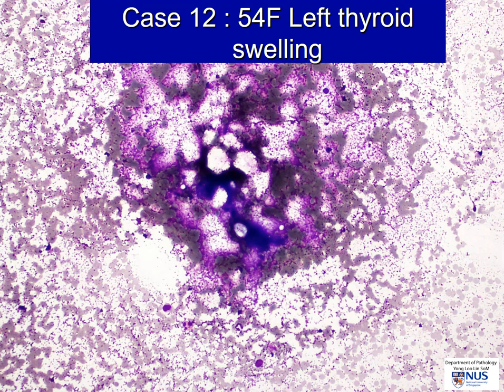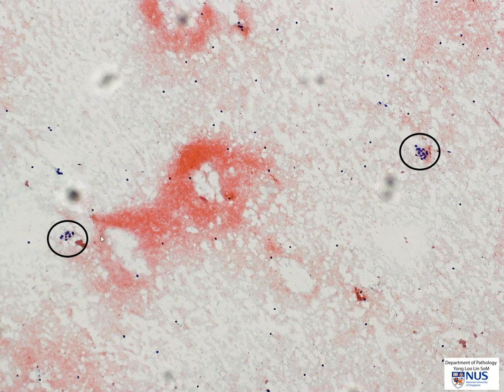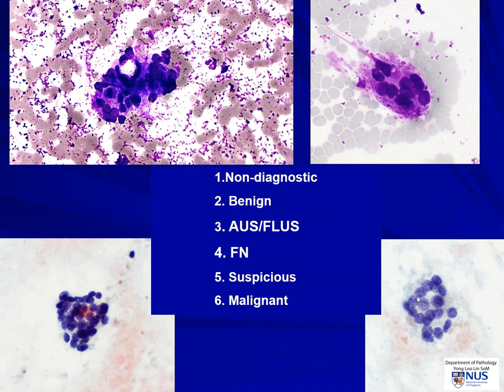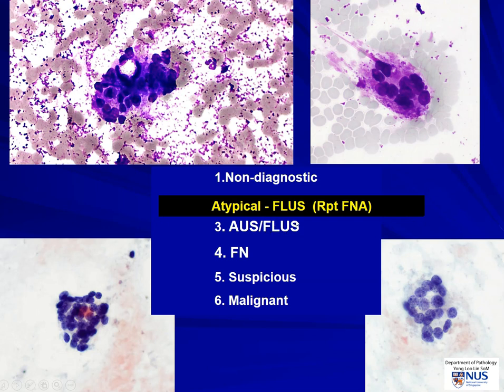I want to highlight one case: a 54-year-old lady with a left thyroid swelling. We can see that there is not much cellularity, and we really have to hunt for cells. However, there are too many to call this non-diagnostic — the cutoff is about six groups of 10 cells each, roughly 60 cells for adequacy. The cells do form small, rounded, and somewhat crowded clusters, and we also have some micro follicular formations. But because there are so few cells and we are not sure whether some are artifactual due to blood clotting, it's very difficult to categorically say that this is a neoplasm. This is an example of a case that will fall into the FLUS category — in the indeterminate, atypical category in the Bethesda system — with management to repeat FNA or to offer molecular testing if available.